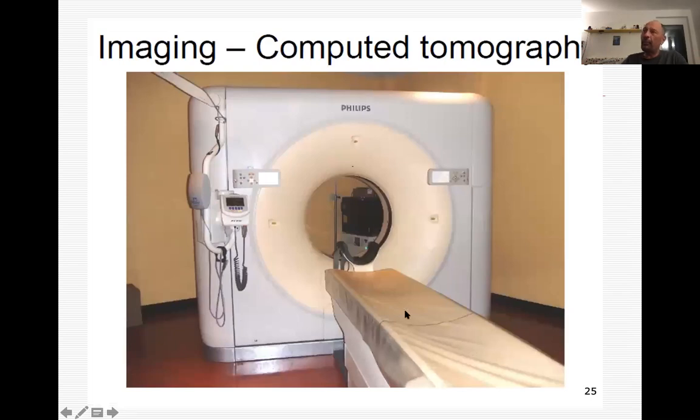Now, imaging, we will have a dedicated lecture on imaging, but the basis of imaging is the computer tomography. It has been said many times that CT is the most important innovation in radiotherapy since Röntgen. So after Röntgen comes Hounsfield with the CT, because imaging has completely revolutionized radiotherapy, because of course, now you can see properly in 3D what you have to irradiate. Before CT, you can only see in 2D. Now you can see in 3D, and this has changed radically.